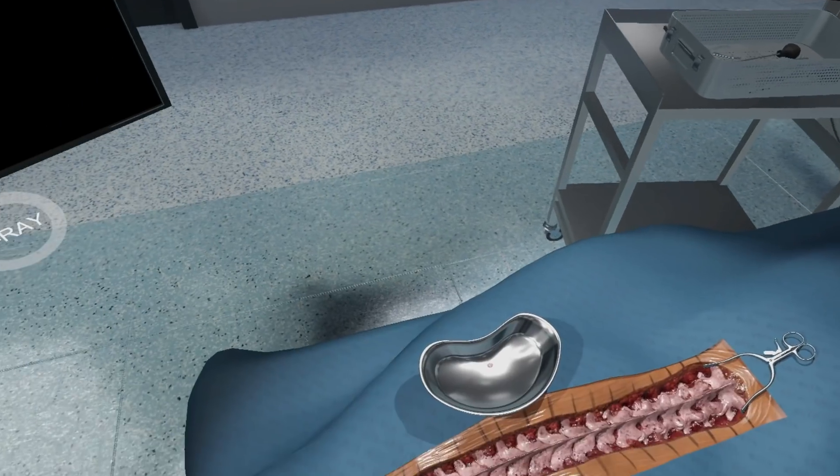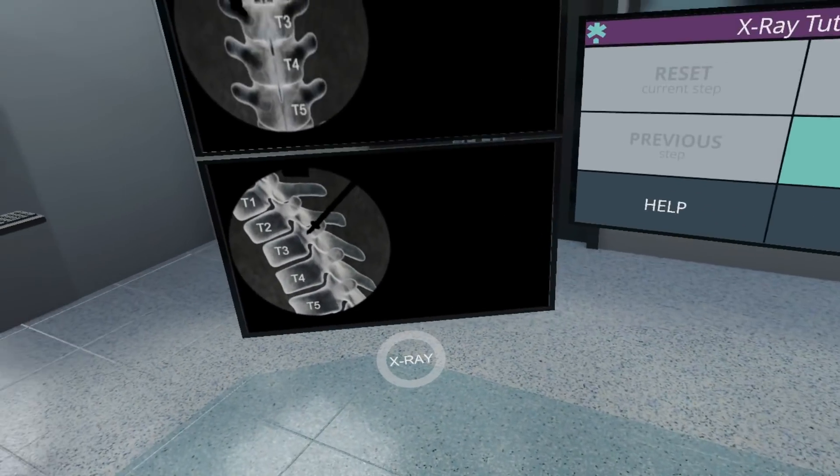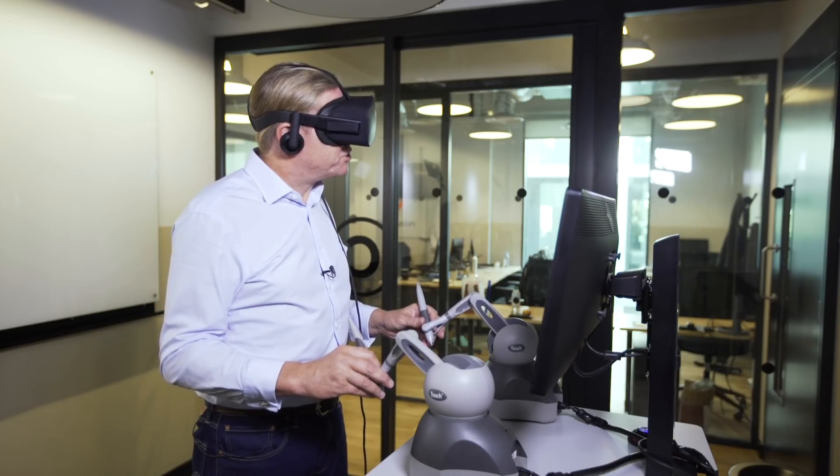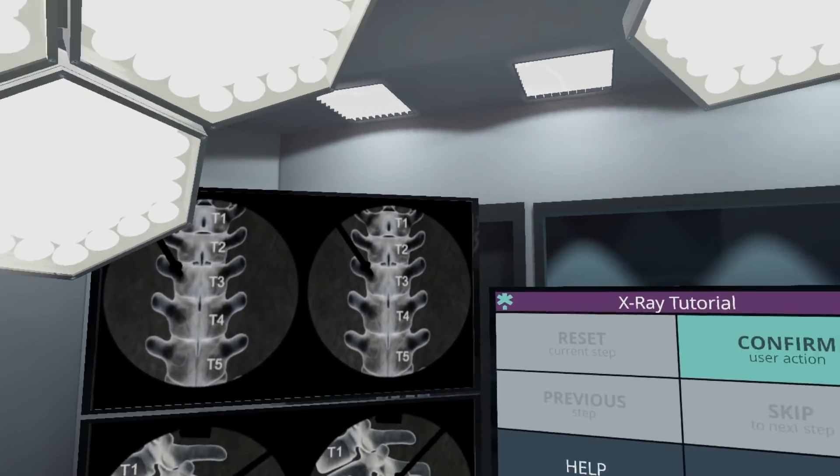What I'm also able to do during the procedure is use the x-ray to check I'm in the right position. Here you can see on the x-ray that I'm going into T3 nicely in both transverse and sagittal planes.